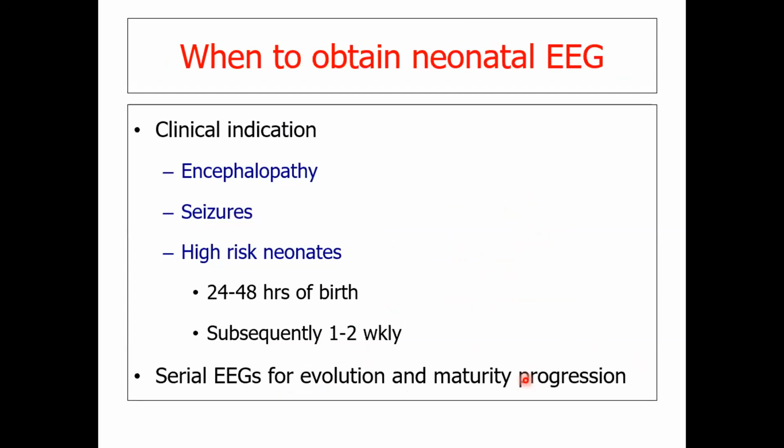So as has been told already, when to obtain neonatal EEGs, whenever you think about a neonatal EEG, you do it. In the NICU, all high-risk neonates, at least within 48 hours of birth, should have an EEG.